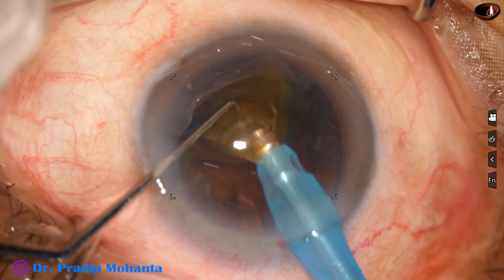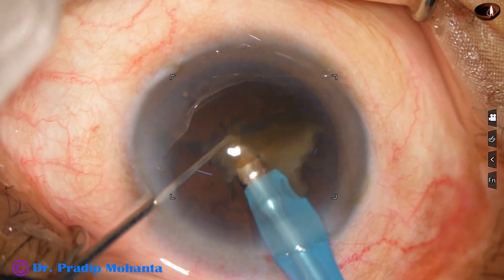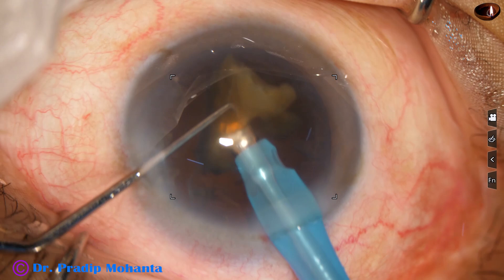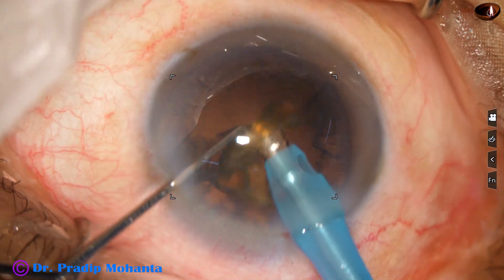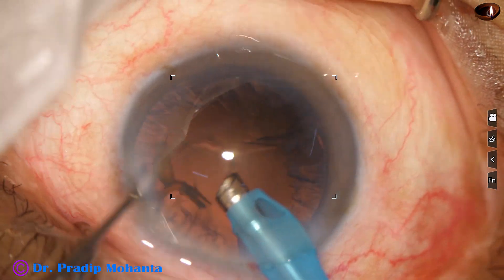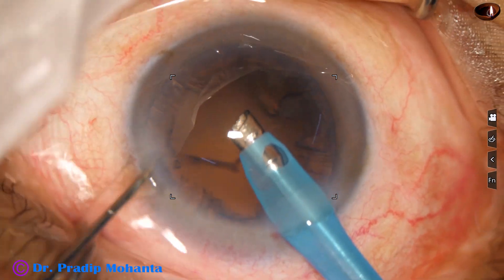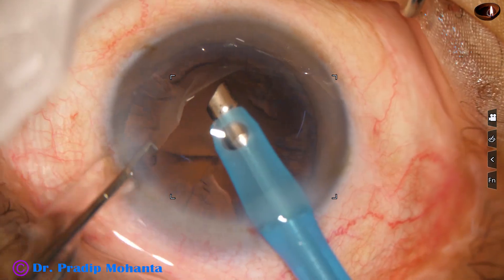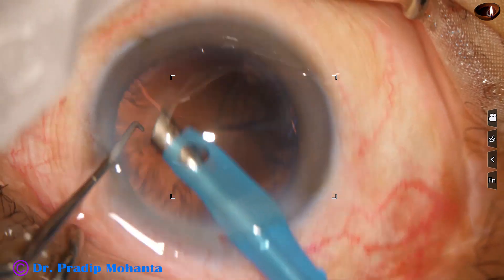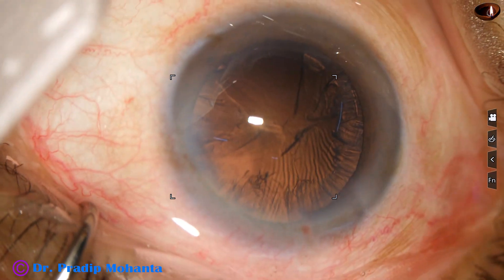And this is the last piece. Towards the end of this piece, I decrease the parameters — vacuum is about 250 and flow rate about 30, and the piece is emulsified. Care is taken to watch the movement of the posterior capsule. If there is some trampolining, we should be more careful. We can do a viscoelastic scaffold for emulsification of the last nuclear piece.